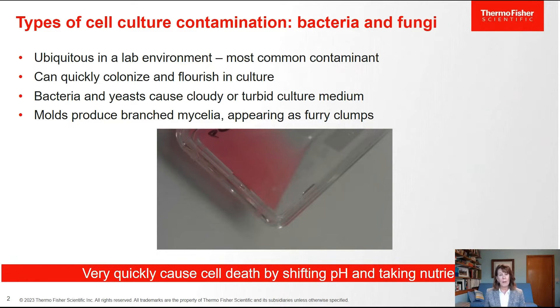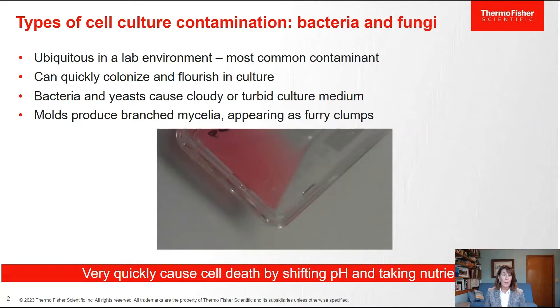Bacteria and fungi are the most common type of cell culture contaminants because they're everywhere — on our skin, in the air around us, in the environment, and they grow so fast. On average, mammalian cells double roughly once per day, but E. coli double once every 20 minutes. So you can see how they can quickly colonize your culture and go crazy growing really fast.